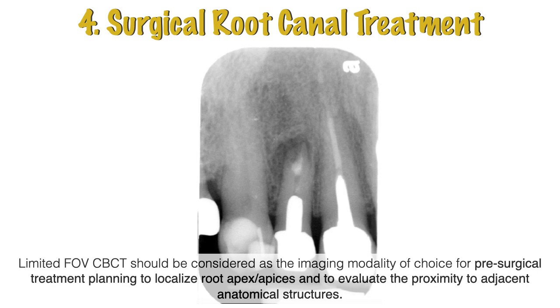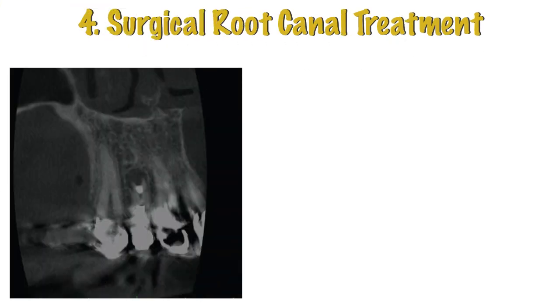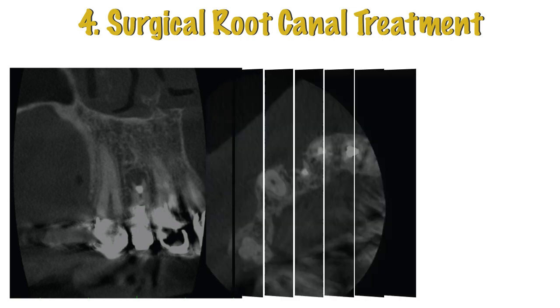We will talk about this case later in our lecture about surgery, but a previous surgery had been done on this 1, 2 here, and it's not working. We see that there is apical periodontitis there. Thick post and crown. So this is the corona view there. We can see the size of the radiolucency better.